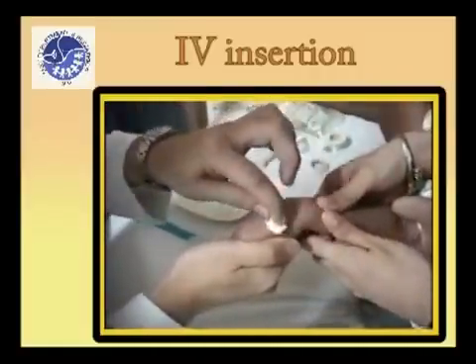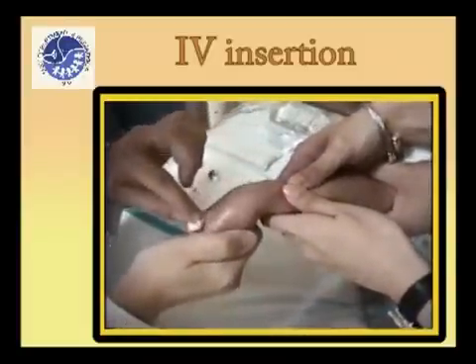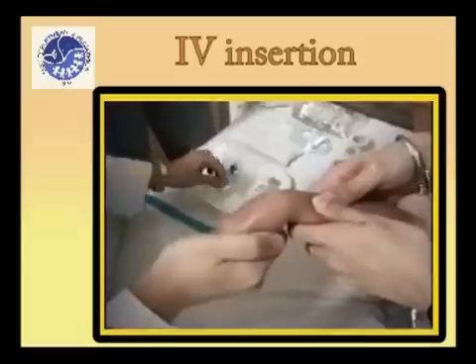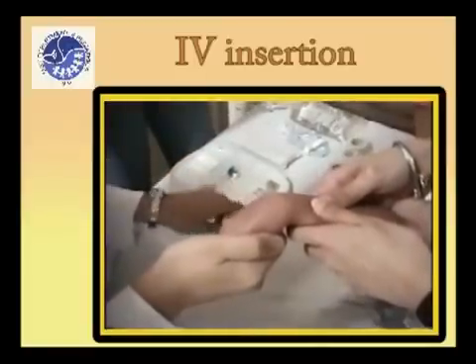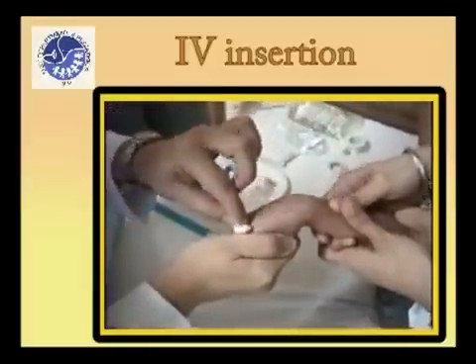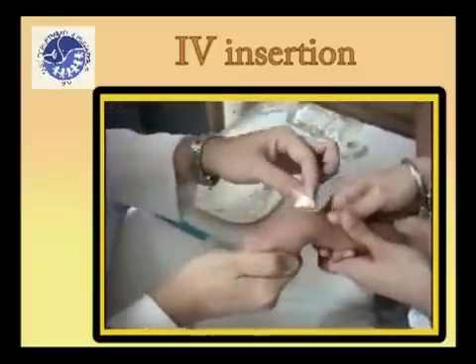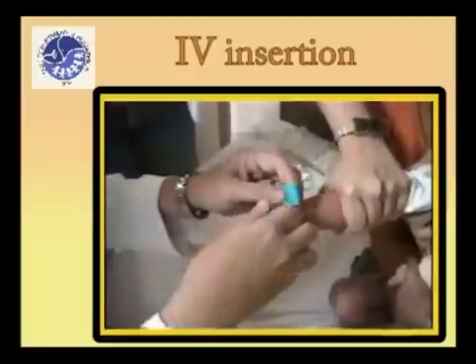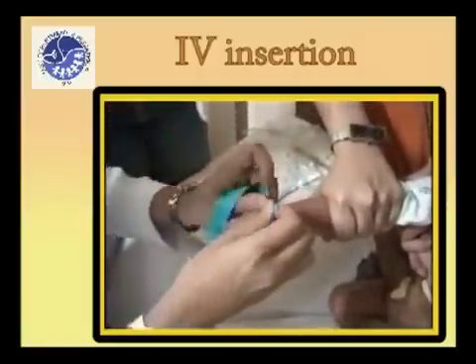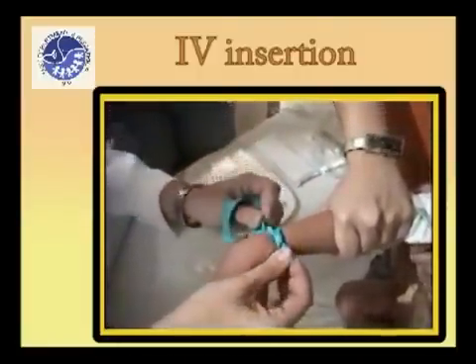Cleanse the hand with antiseptic solution. Allow the antiseptic to dry. Apply the tourniquet to the forearm. If veins are not visible, rub the surface briskly with alcohol to distend the vessel.